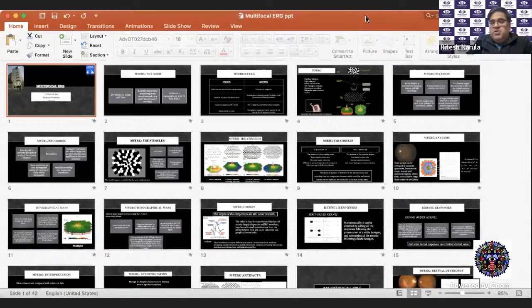And the electrophysiology was the one which actually helped us document loss of perfusion and monocular ischemia, on the basis of which we could actually convince the patient that this needs further treatment. Otherwise, he was just being labeled as mild NPDR, though the iris had started showing neovascularization. So in NVG, it is a very useful tool, in any vascular condition, wherever in doubt.